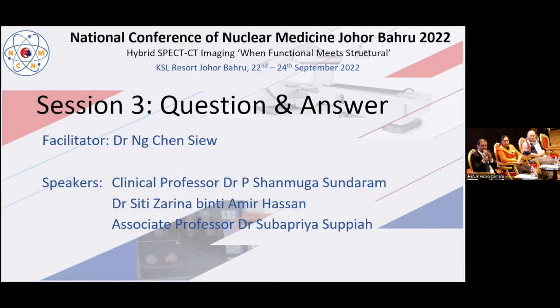But now, with the availability of choline PET-CT, I think even that will reduce. But there are many proponents, surgeons, who want to have 4D CT because it gives excellent anatomical location to them. That's where I like to use a low-dose CT on our equipment, 40 to 80 mA, even though it is a non-contrast CT, to give anatomical localization. But to the question, yes, 4D CT when nuclear scans and ultrasound fail to identify the pathology.